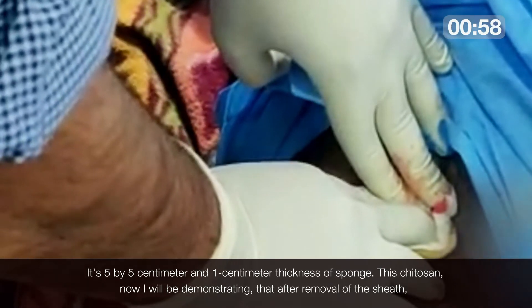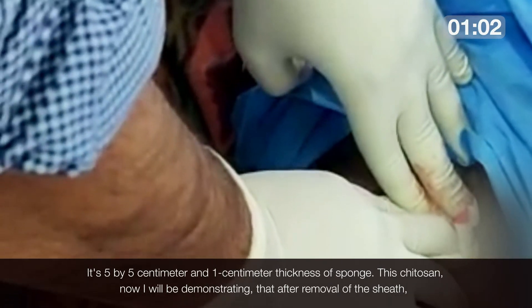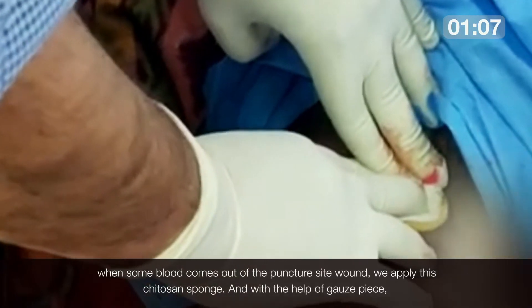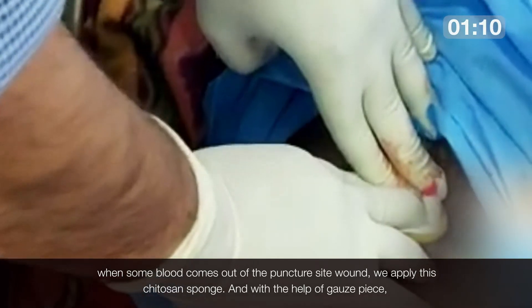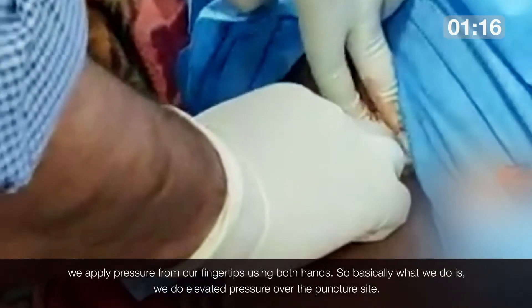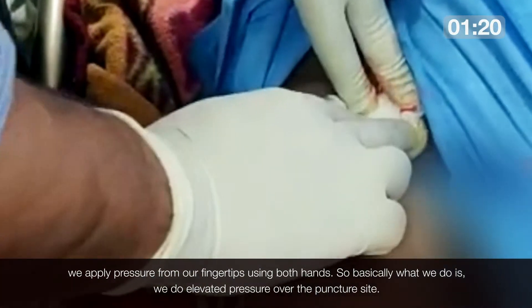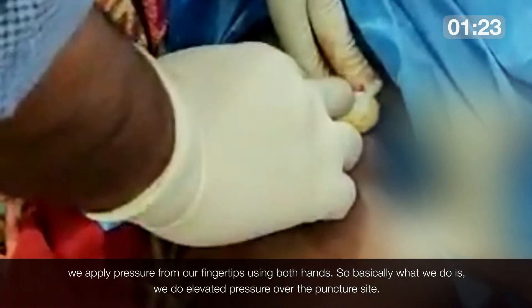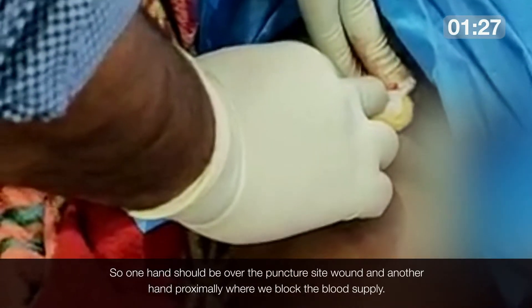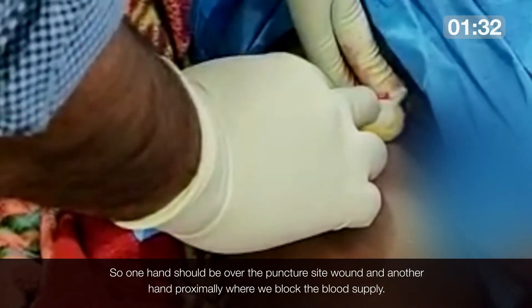I will now demonstrate that after removal of the sheath, when some blood comes out of the puncture site wound, we apply this chitosan sponge, and with the help of a gauze piece we apply pressure using our fingertips with both hands. One hand should be over the puncture site wound and another hand proximally to block the blood supply.